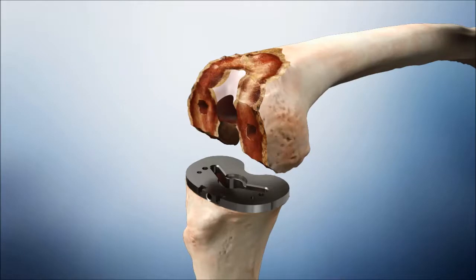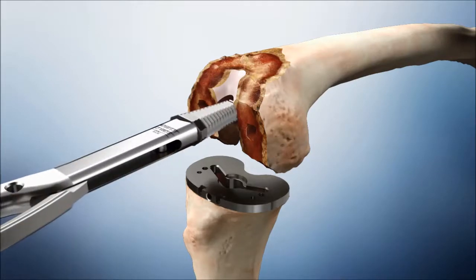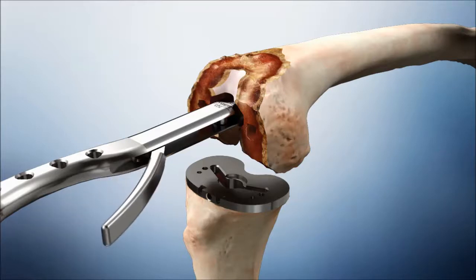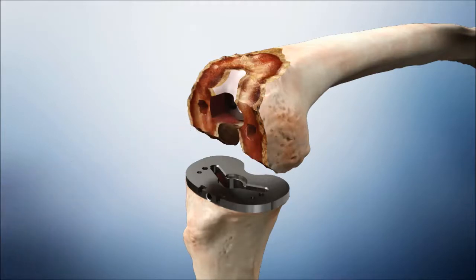Assemble the stem trial to the smallest femoral broach. Ensure that the medial marking on the broach handle is facing medially and impact into the femur until the TC3 line on the broach handle is at the planned level of distal resection. Sequentially broach until the broach is rotationally stable in the canal. Remove the broach handle, leaving the broach in the canal.